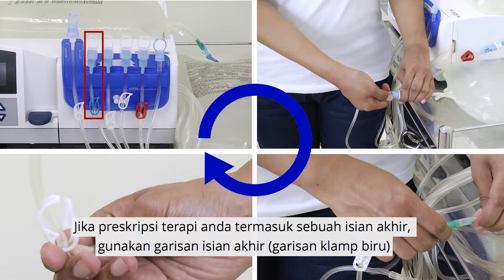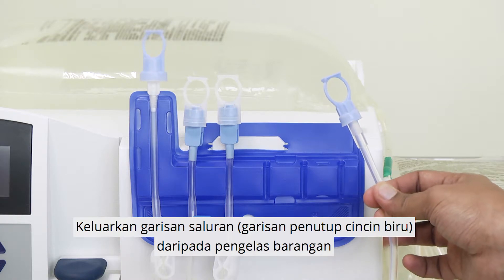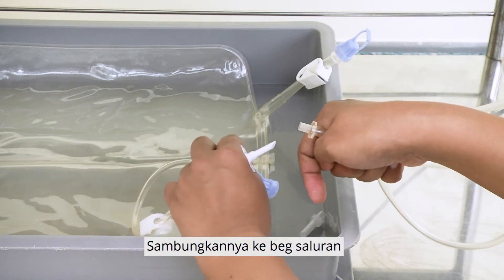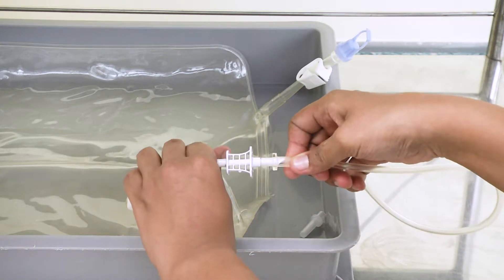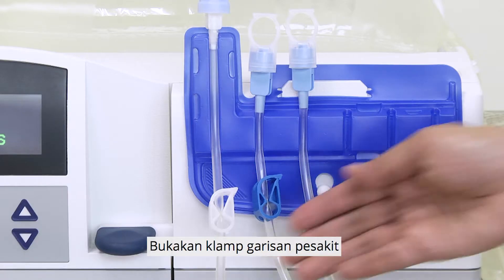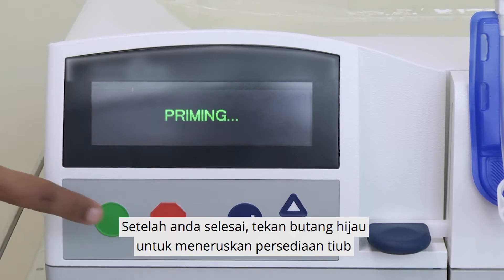If your prescribed therapy includes a last fill, use the last fill line. Remove the drain line from the organizer and connect it to the drain bag. Close the big white clamp on the drain bag. Open the patient line clamp. Once you are done, press the green button to proceed with priming of the lines.